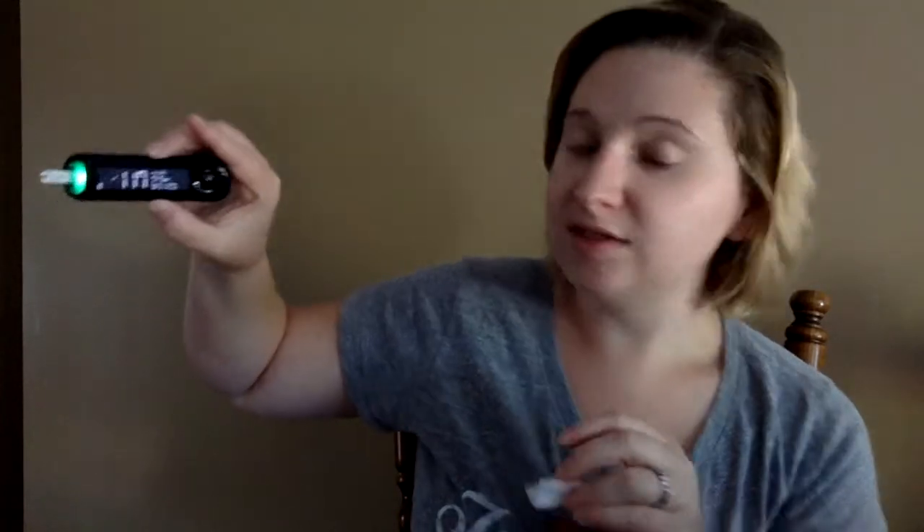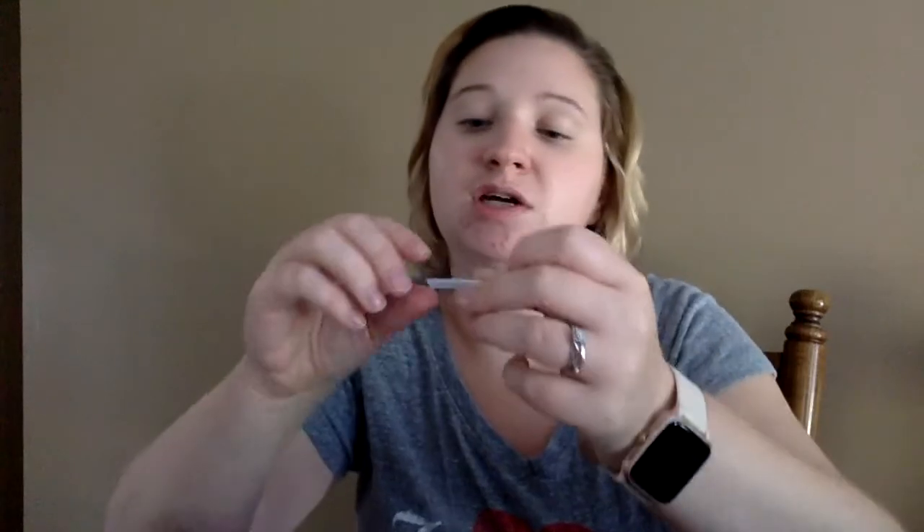Pushing out the blood and then my Contour Next one — waiting to see if that takes. That one counts it down. 117! So we're all around the same area. This one was 114, my Dexcom said 118, and then my Contour Next said 117. I like this for the most part — I'm not crazy over the strips. The strip opening is a little wider than I'd like, which makes it a little more difficult, whereas the Contour Next goes directly up the strip, making it a little bit faster. But it's not a deal breaker at all.